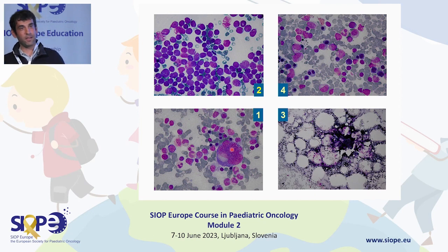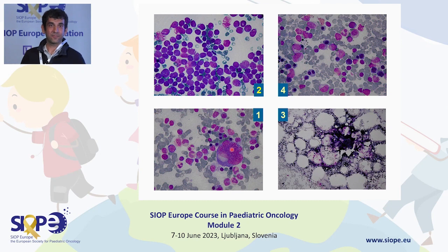So what may this patient have? Severely thrombopenic. ITP, yeah. Because it's bleeding. Okay, that was the clue with this case.